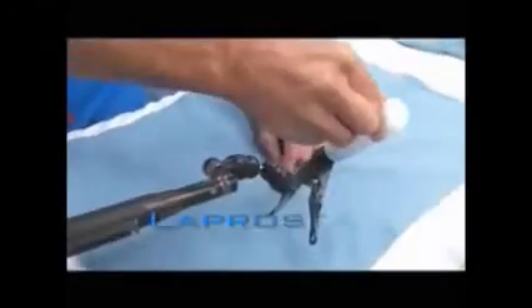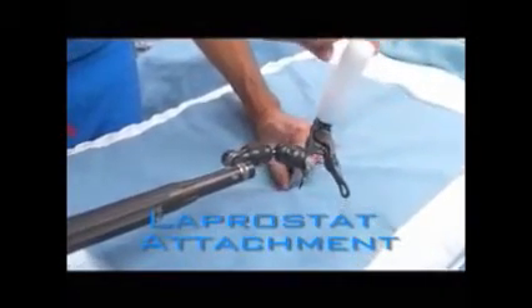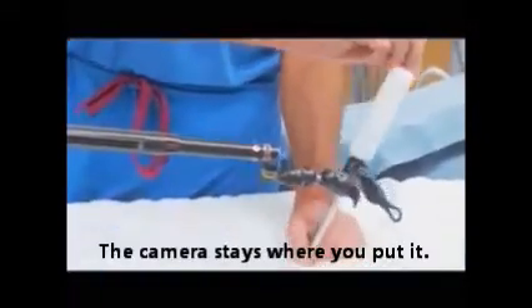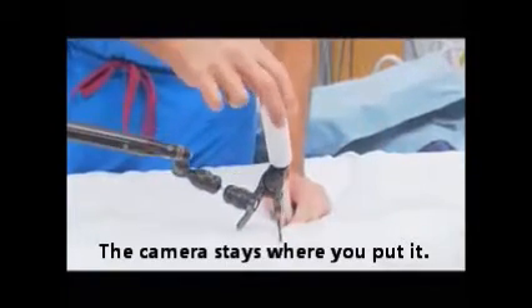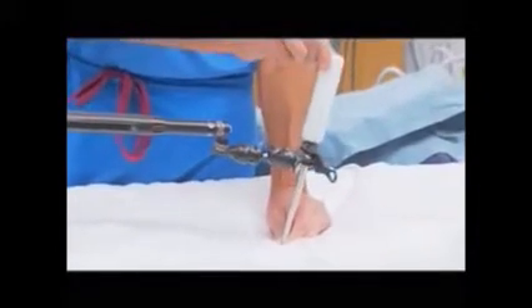The laparostat attachment consists of rotating and sliding joints and a clothespin-type clamp with soft jaws for grasping laparoscopic instruments. The device allows complete freedom of movement using light manual force and will hold the instrument still when released. The attachment can be positioned in almost any desired orientation to avoid interference with adjacent instruments.